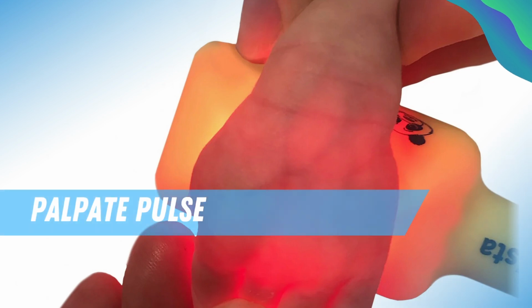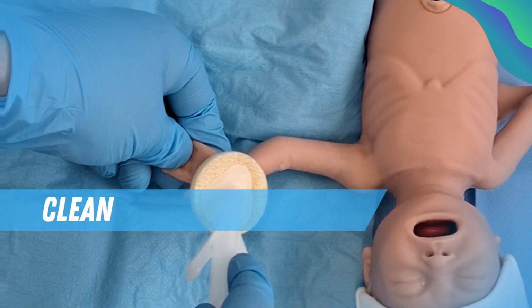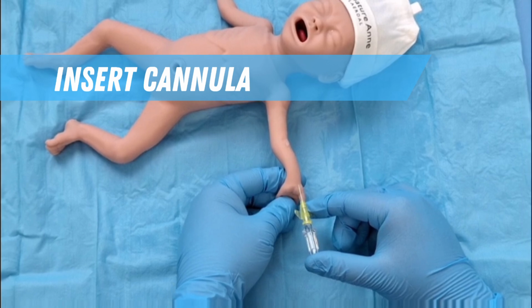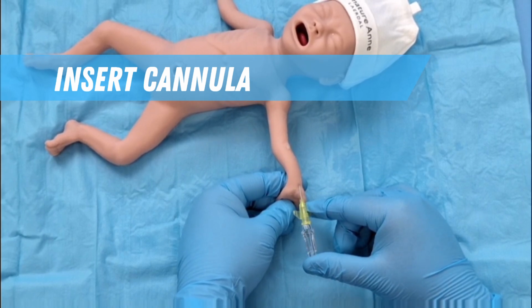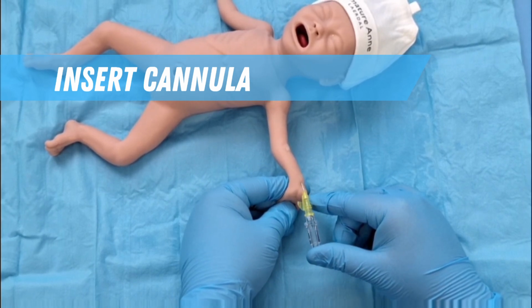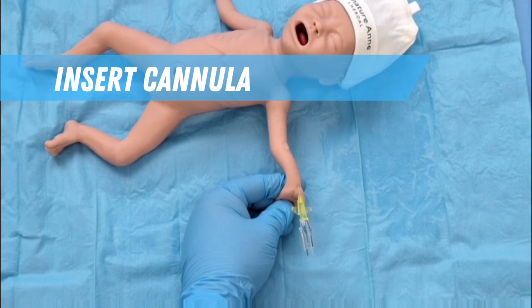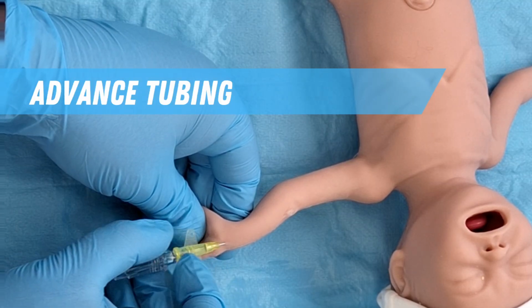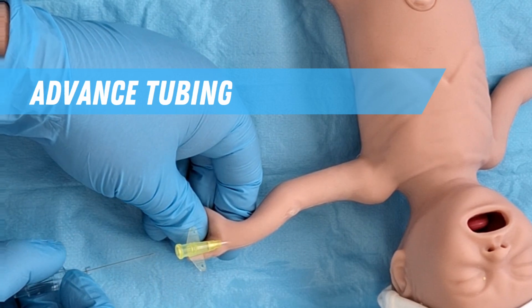In premature babies, it may be useful to place a transilluminating vein finder device under the wrist to assist with visualization of the artery. Clean the area and allow to dry. Slowly advance the tip of the cannula through the skin. Advance at a 45-degree angle slowly until flashback is obtained. Slowly advance the plastic cannula tubing over the needle. It should advance easily and the needle can be removed.